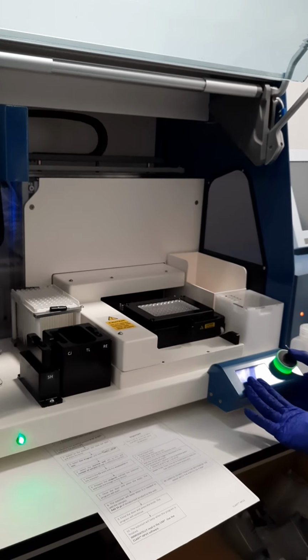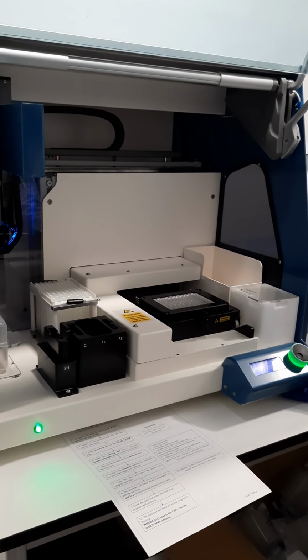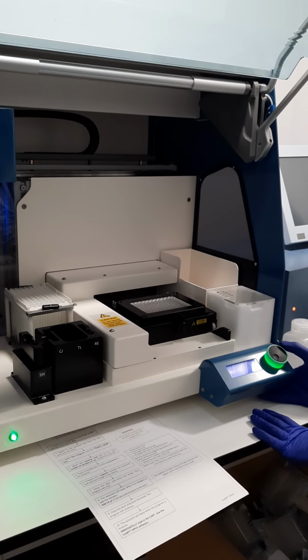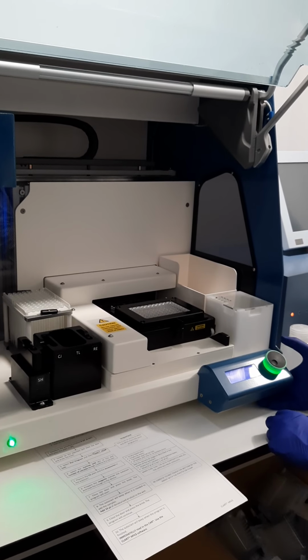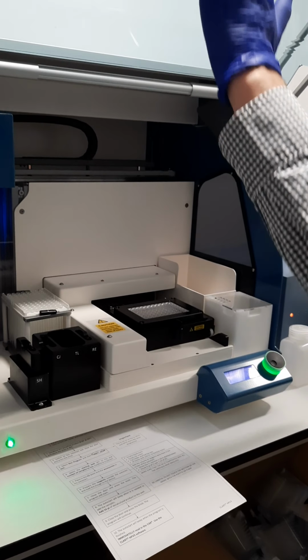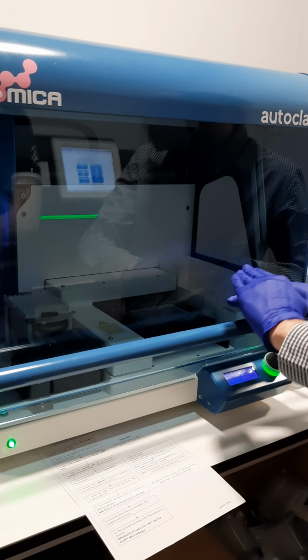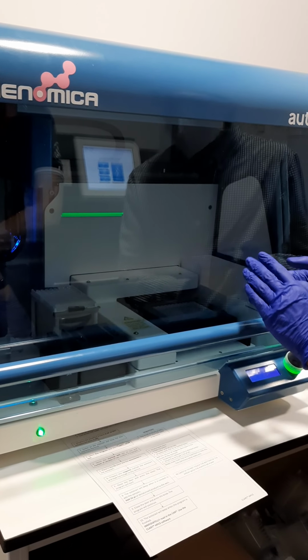Then it's going to do the last step: close the door and press the button to start. Okay, we aren't going to do it, but if you want to abort, we press here, rotate and press, and then what we do is close the door, press start. It will start adding the TL, washing the arrays with this TL, and then adding the hybridization solutions.